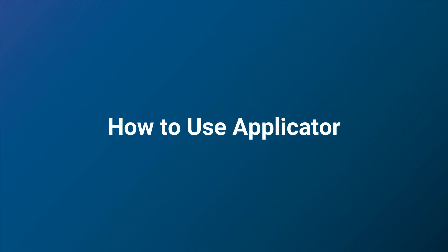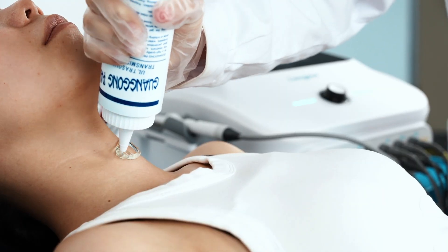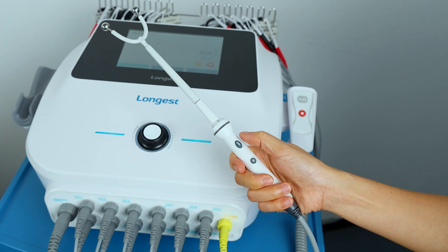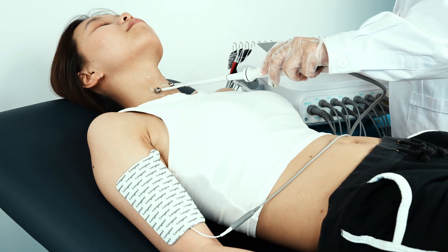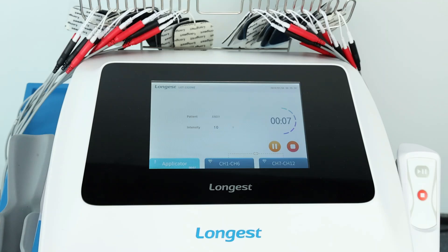Now let's walk through how to use the applicator for more precise treatment. Clean the treatment site and where the electrode pad is placed. Pick up the applicator and attach the electrode pad to the client. Apply gel on the treatment site. Choose the applicator channel to enter the parameter setting interface. Adjust the parameters using the rotary knob. After completing the parameter setting, press the start button to start the treatment. Press the start button on the applicator to activate it. Then click the intensity boxes and adjust the intensity using the rotary knob. Move the applicator around the treatment site. Monitor the client's comfort throughout the session. Once the session is complete, the buzzer will sound three times and the device returns to the pre-start state.